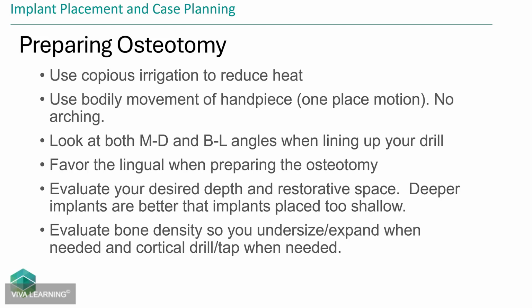In general, when it comes to the osteotomy, copious irrigation, bodily movement of the handpiece, that just means you're not fulcruming, you're not arching. When you're doing your implant placement, you need to be doing a straight up and down placement. It takes just a little bit getting used to, and then it'll become very standard.